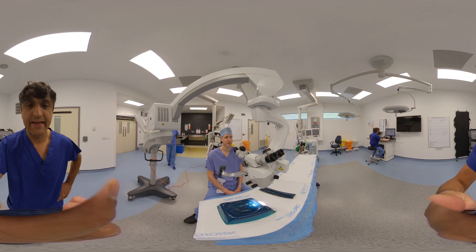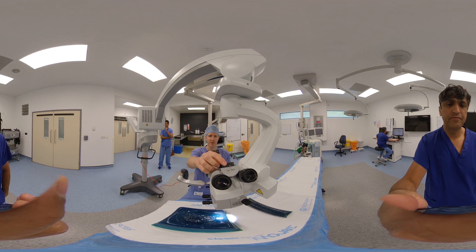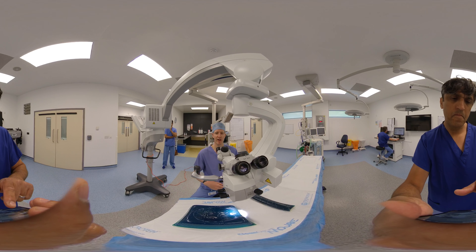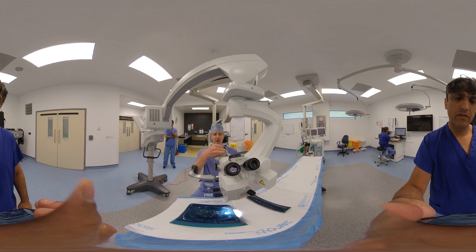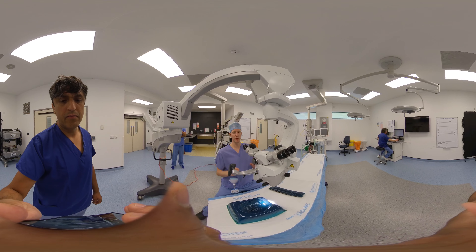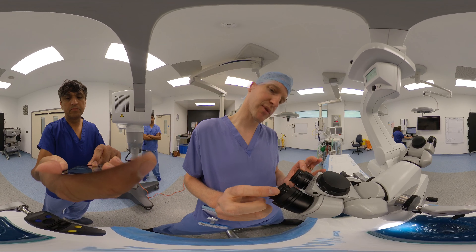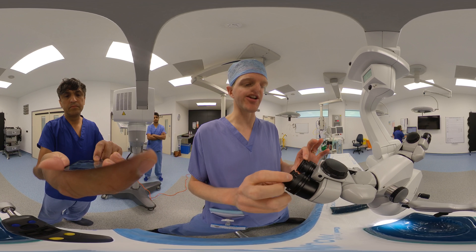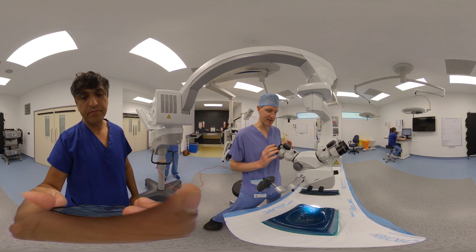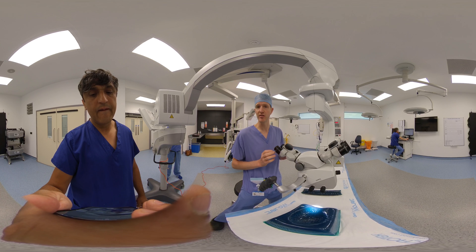The interpupillary distance setting on this particular brand of scopes is done at the very top and obviously varies from person to person. When you're first starting out in microsurgery, you just need to have a play around with this and see what works for you. For me, I'm 64, so you just adjust the dial to fit your interpupillary distance. Many scopes also have a gauge that allows you to adjust the focus, so people who require glasses can take them off and adjust this to operate in the same focus as someone without glasses. Most people, however, tend to leave this centralised at zero and operate with glasses on.